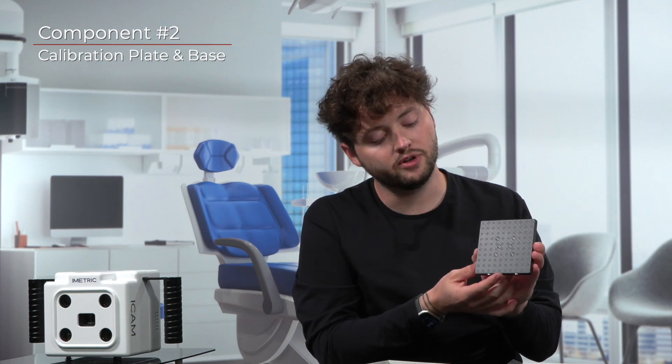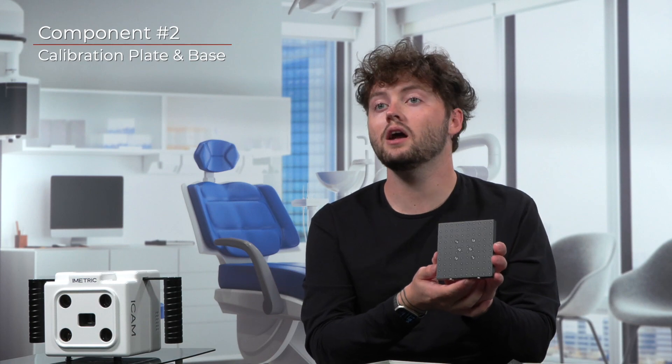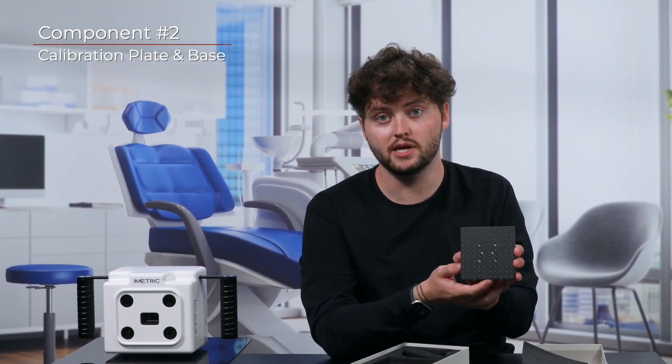Your hands actually produce oils that will deteriorate the surface, making the plate unable to be recognized by the camera system. This piece of equipment is vital to the process of measuring implant positions, as this process includes calibrating the camera system prior to every case or measurement.